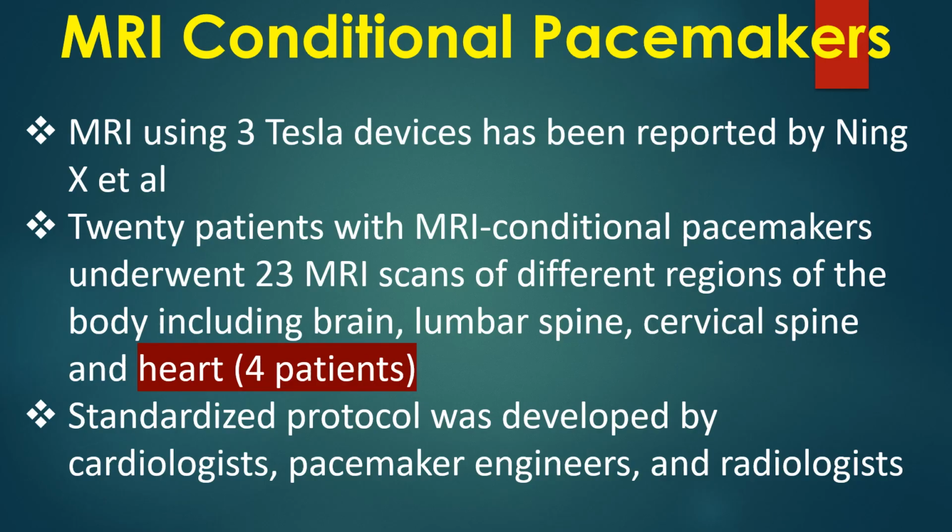MRI using 3 Tesla devices has been reported by Ning and colleagues. 20 patients with MRI conditional pacemakers underwent 23 MRI scans of different regions of the body, including brain, lumbar spine, cervical spine, and heart. Standardized protocol was developed by cardiologists, pacemaker engineers, and radiologists.